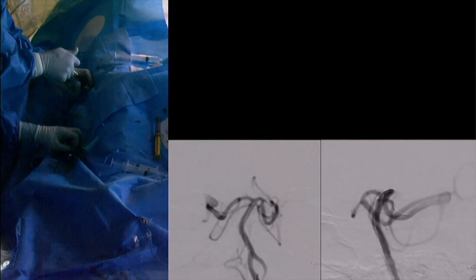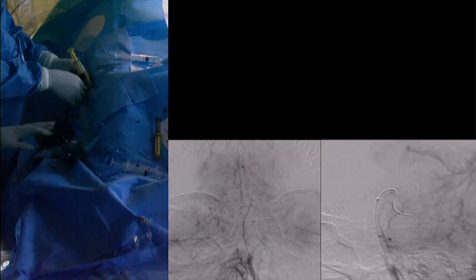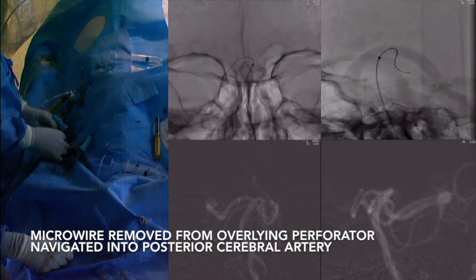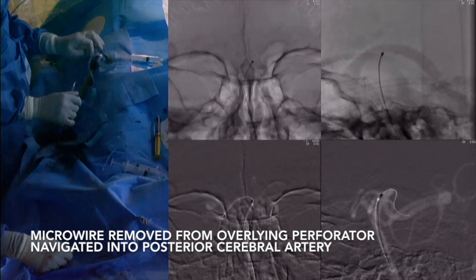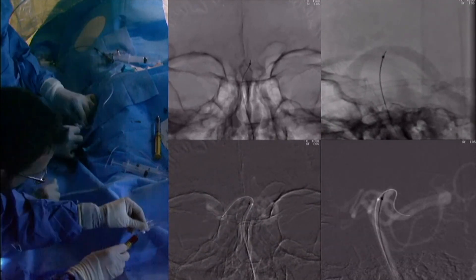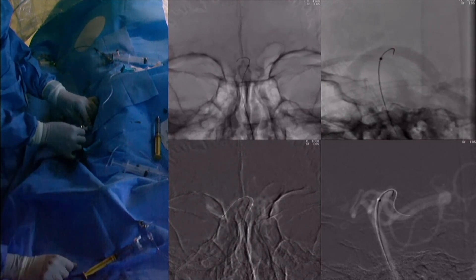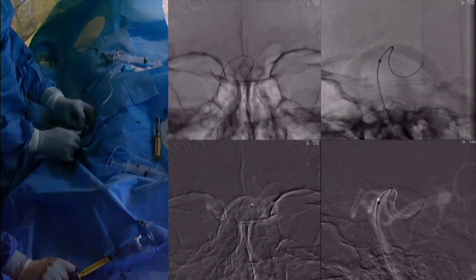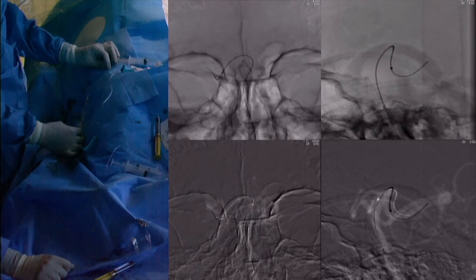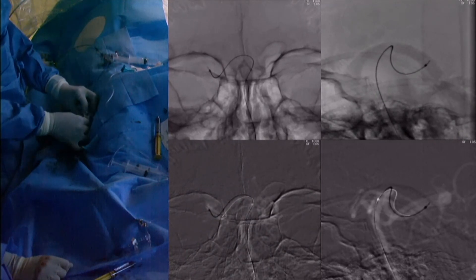And as you can see, the wire is not in the posterior cerebral artery, but rather it is in a large perforator. It is critical to develop a feel as well as visual understanding when the wire does not quite match the road map. It is very easy to become confused and access a perforator which overlaps on angiograms the posterior cerebral artery. Great care must be taken not to access the perforator, or to understand that one is in a perforator, to avoid the complication of rupturing these basilar perforating vessels.